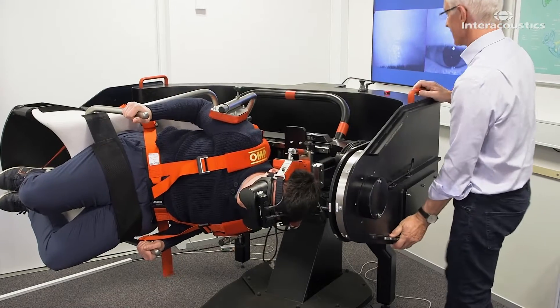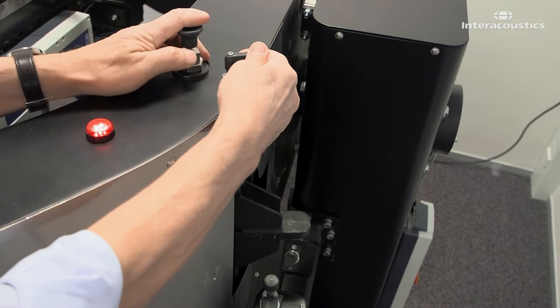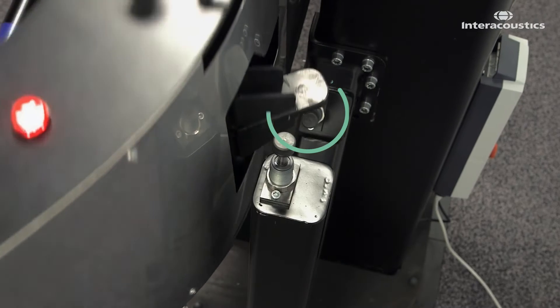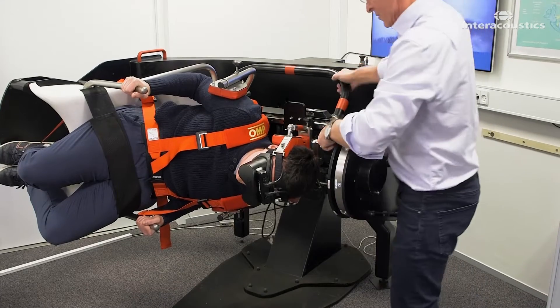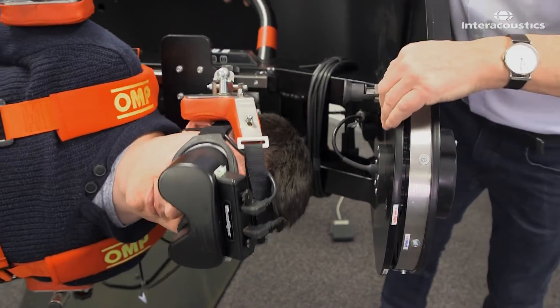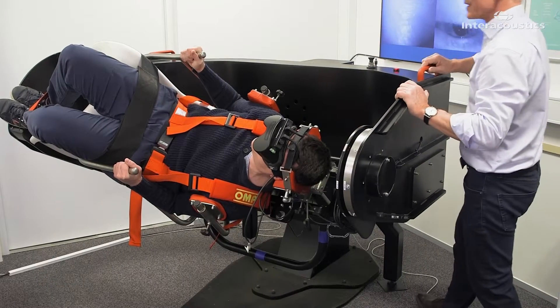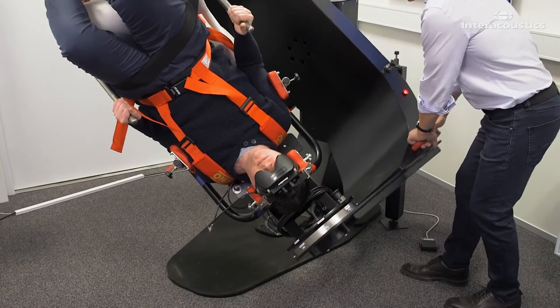Raise the main arm slightly above horizontal. While holding the main arm, move the augmented stop arm to the downward pointing position, where it will collide with the lower shock absorber. Rotate the secondary arm 45 degrees over the unaffected ear. Apply 12 rapid decelerations in this position.